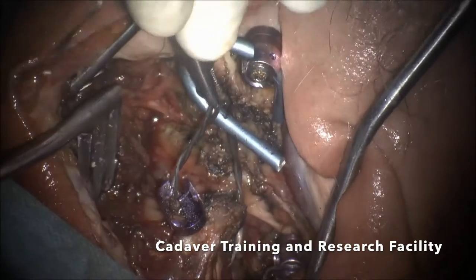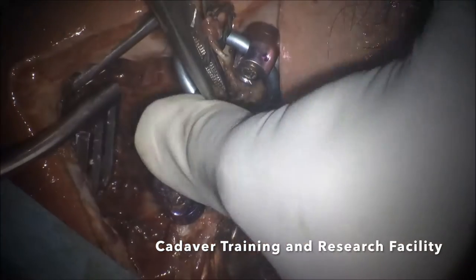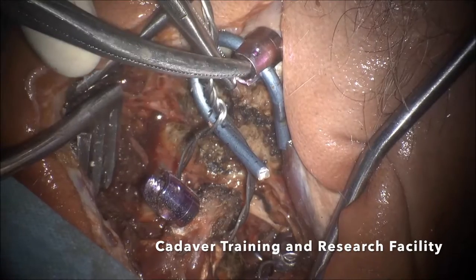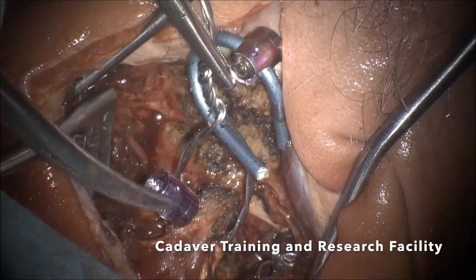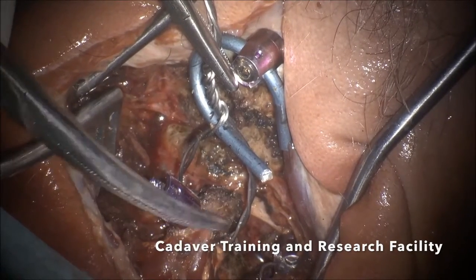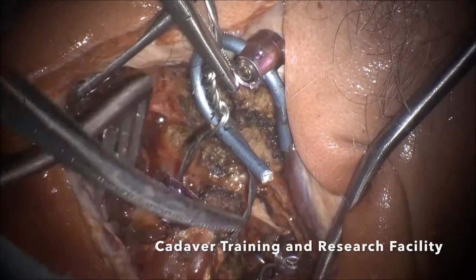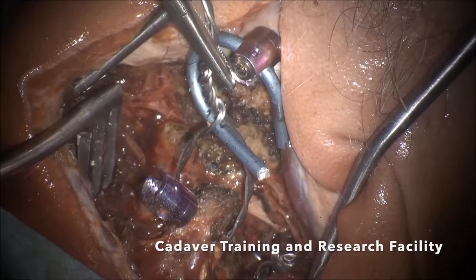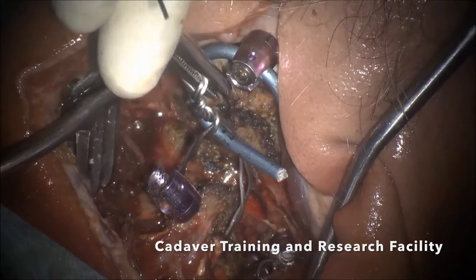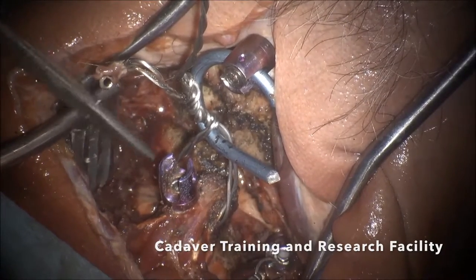Now I am starting my compression. You will notice that C2 starts moving cranially. If you try to wire directly without the rectangle, you are pulling C2 up posteriorly — C2 going up posteriorly is disastrous because the dens is going to move backwards. So the whole idea is C2 should go in the cranial direction rather than coming up in a posterior direction. The rectangle changes the direction of motion of C2. Now you can see that C2 has moved up significantly.